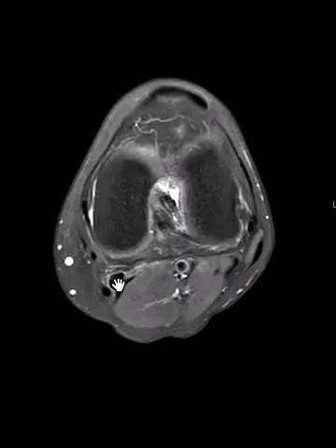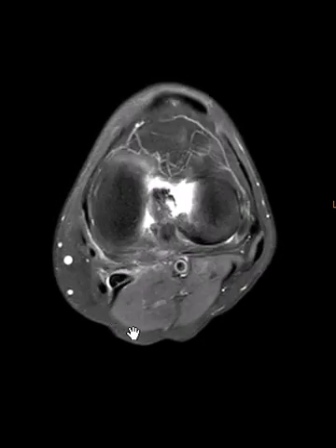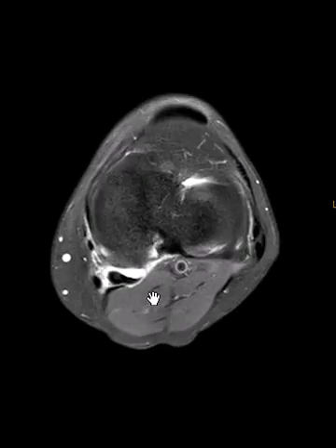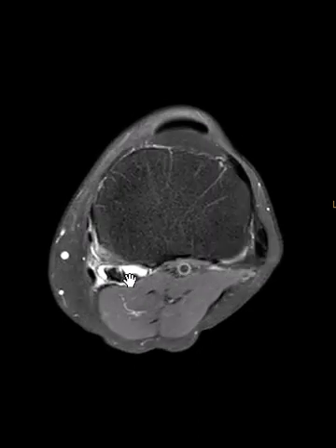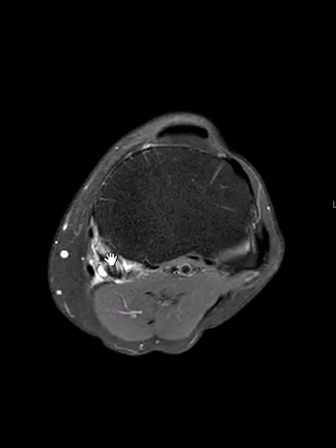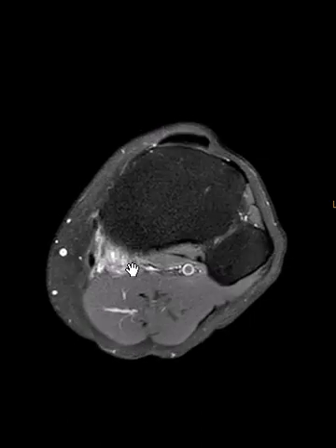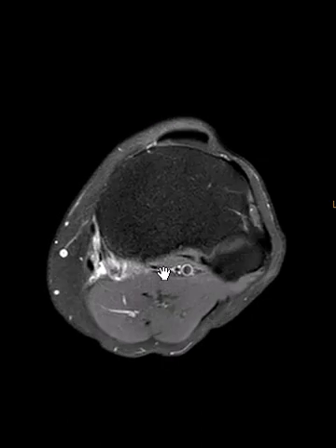We're going to go down, and it's going to get in front of the gastrocnemius here. As we go further down, we now see fluid surrounding the semimembranosus. We see it broaden to attach to the tibia, but it looks pretty irregular — and right here we really start to lose it. Definitely partially torn there, and on the next cut down, we really don't see it very well. So it's a high-grade partial or complete tear of that semimembranosus tendon.